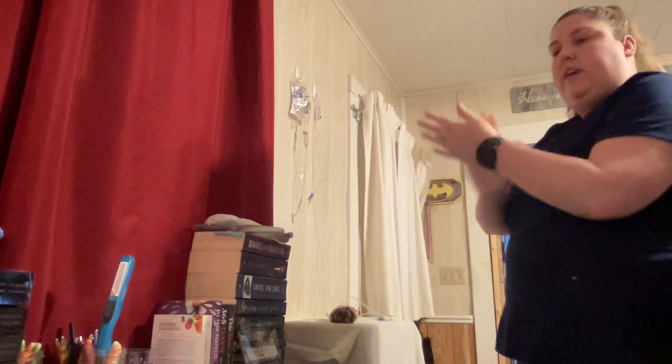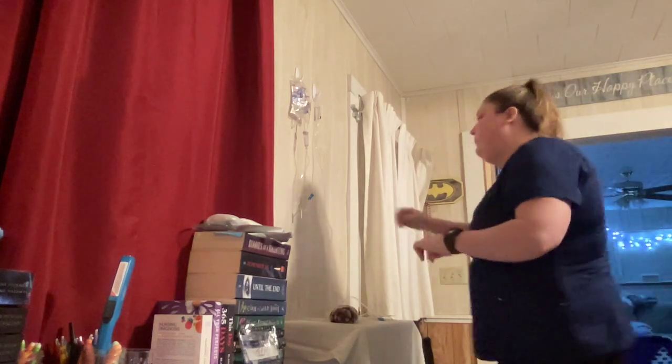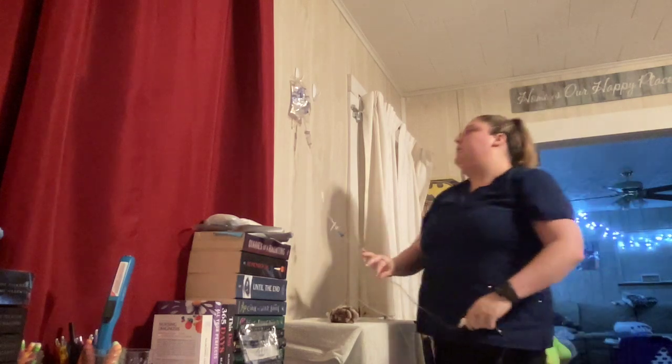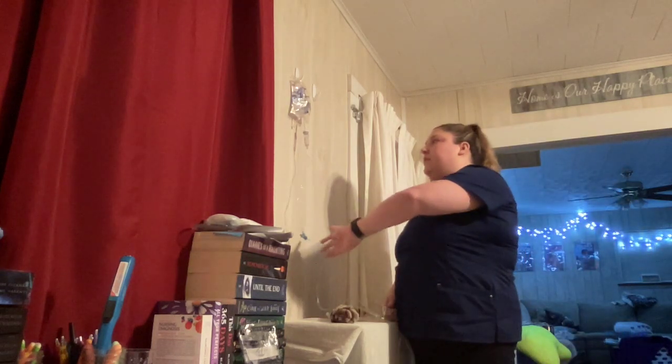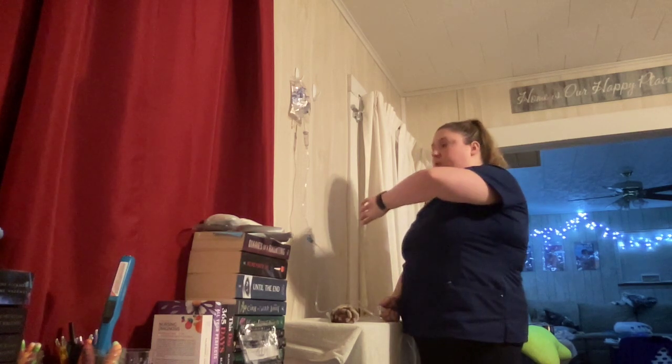All right, the sodium chloride 500 milliliters needs to be a rate of 125. That is 31 drops per minute. I'm going to watch my chamber here. All right, I'm going to start counting.